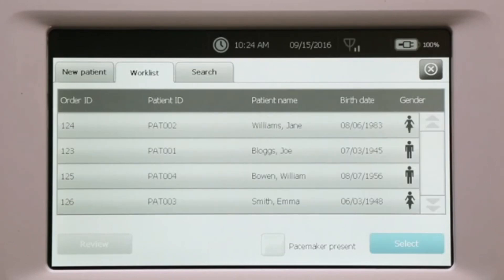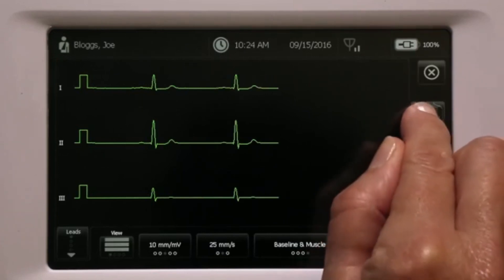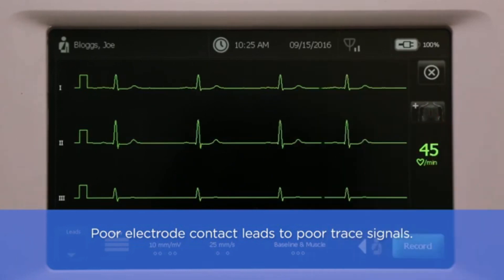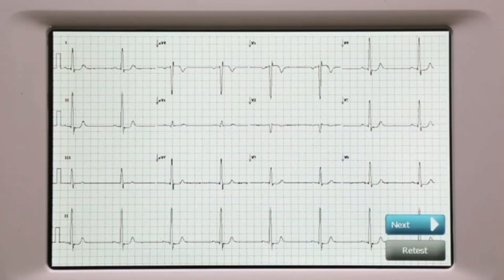Choose the patient and review patient information to prepare for the test. Attach leads to the patient. Please remember, the most common ECG problems are caused by poor electrode contact and loose leads. Touch Record, then press Next if you are satisfied with the captured result, or press Retest if you want to run the test again.